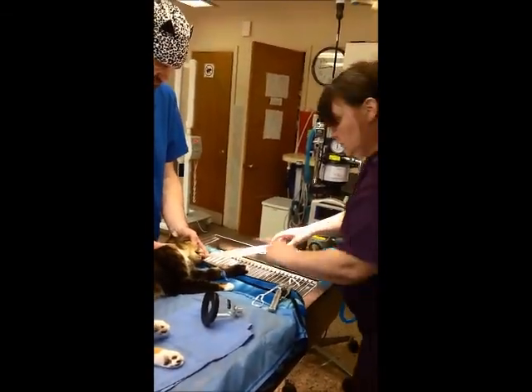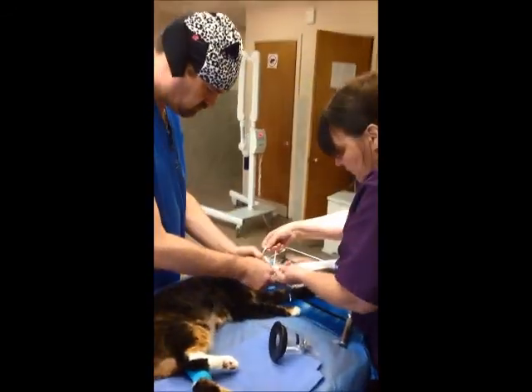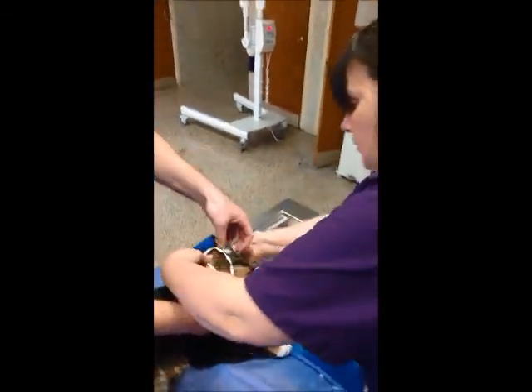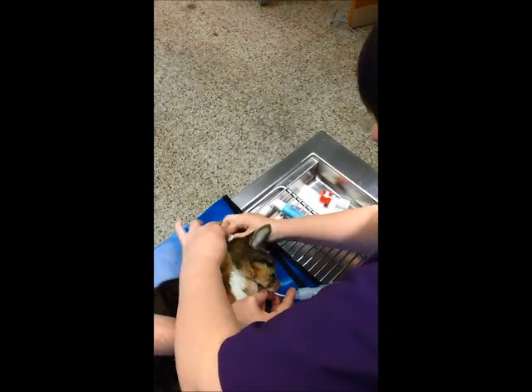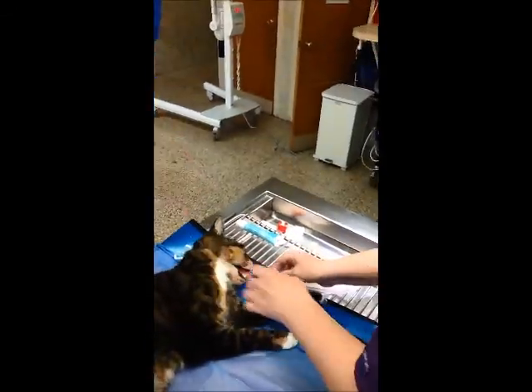See the bag moving. You can see her breath in there too. I'm going to take the string, tie it, and pull it back over her head to tie it in behind her ears. And that's going to hold the tube in her mouth.